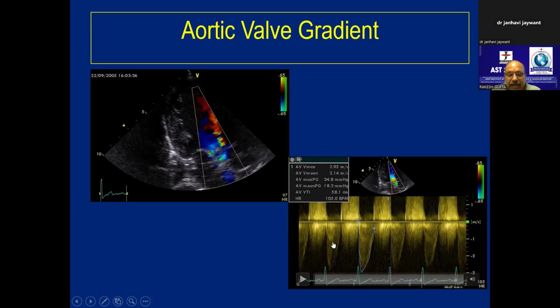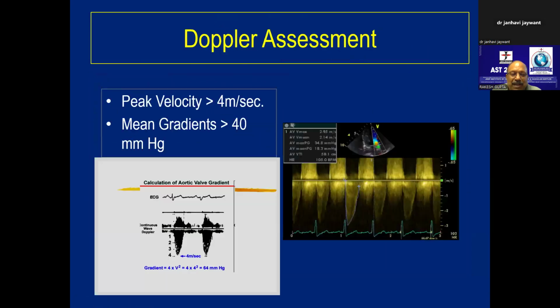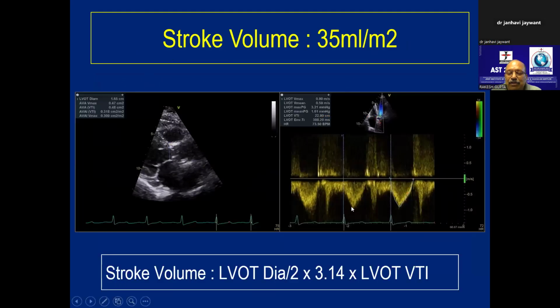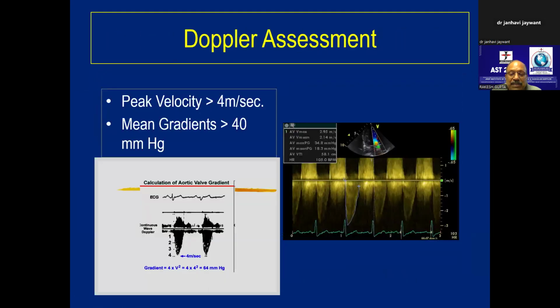Now this velocity is almost 1 meter per second. This is LVOT. Let's go back and see the LVOT velocity. This LVOT velocity is almost 1 meter per second. So if you measure LVOT velocity with continuous wave Doppler, this pattern would be submerged in the Doppler flow pattern of aortic stenosis, and you will not be able to identify it. You can see it over here, but you can't see it over here. So pulse wave at LVOT, continuous wave at aortic valve.